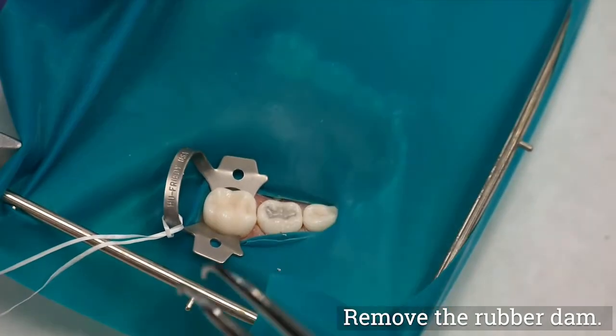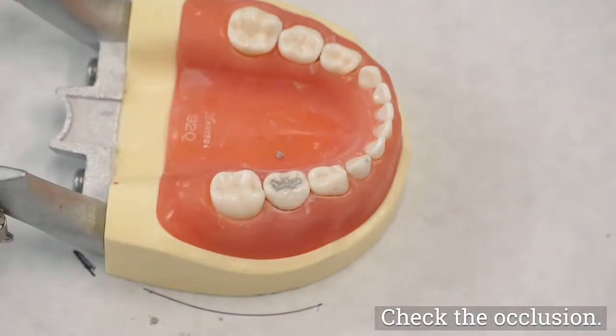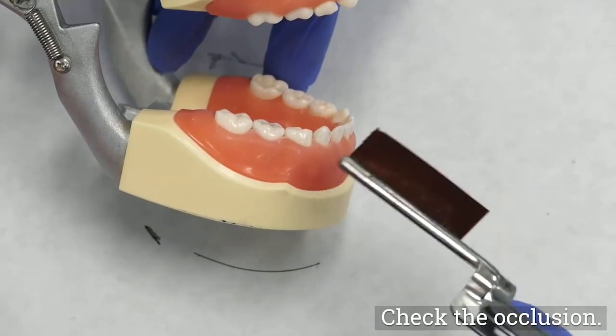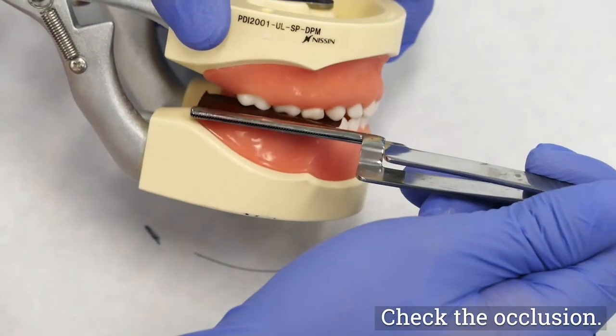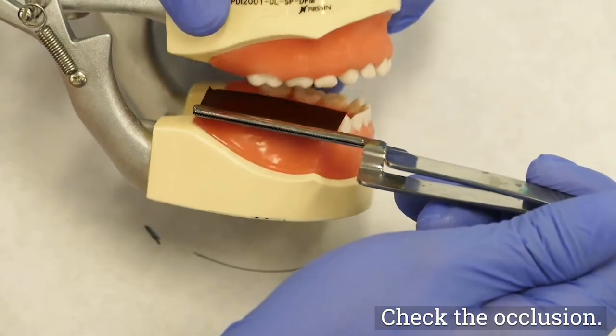Remove the rubber dam and check occlusion. Children must be cautioned before the rubber dam is completely removed to not close their teeth into occlusion until instructed to do so. With articulating paper, check the restoration for occlusal irregularities and make necessary adjustments.